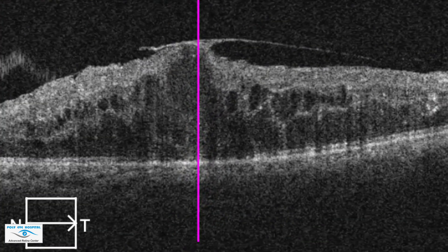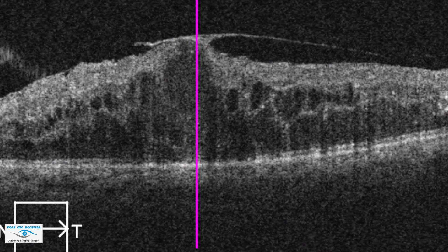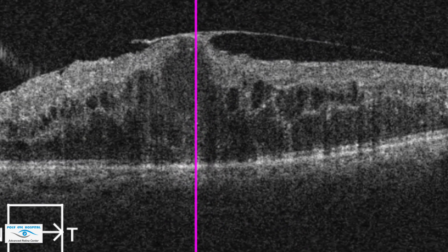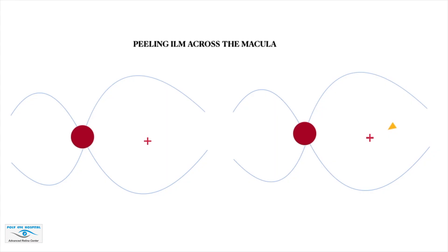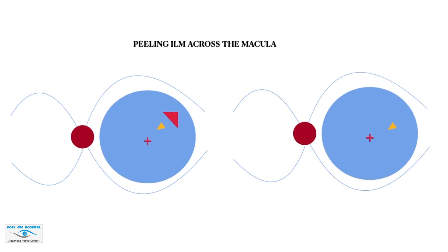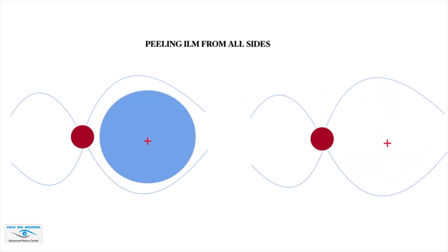OCT of the macula shows edematous retina with a large subfoveal cyst. The roof of the cyst is very thin; any sort of traction will cause its deroofing, leading to a lamellar hole. So if we pull the ILM across the macula, it will cause traction and dragging. Instead, we should peel ILM all around the fovea first and then gently pull the ILM over the fovea in the end.